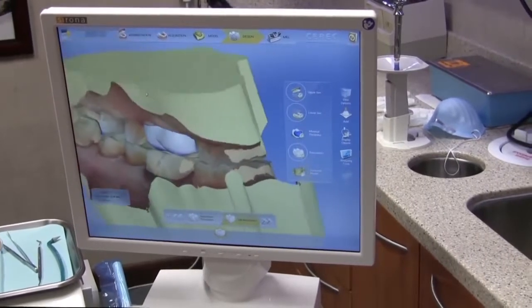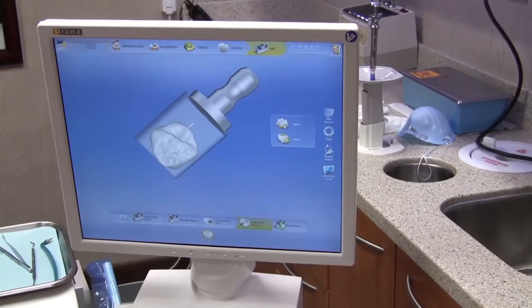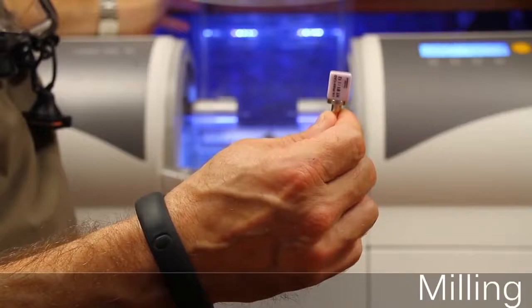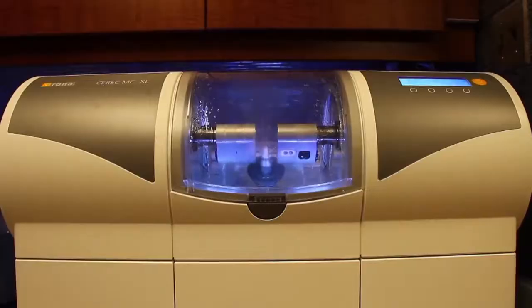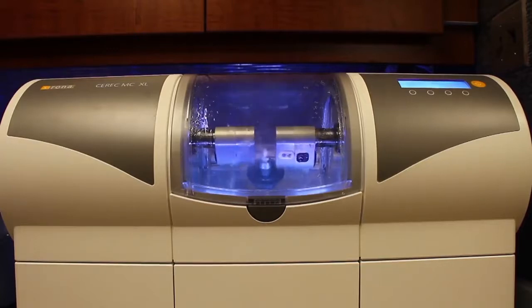After the design of the crown is completed, I forward the information to the milling unit and create the crown. The milling unit uses water with lubricant and two diamond burrs to mill the crown from a block of porcelain. In most cases in my office, it is an Emax material, which is a highly aesthetic and extremely strong material — even stronger than a real tooth.